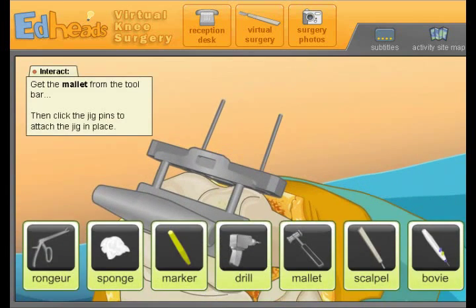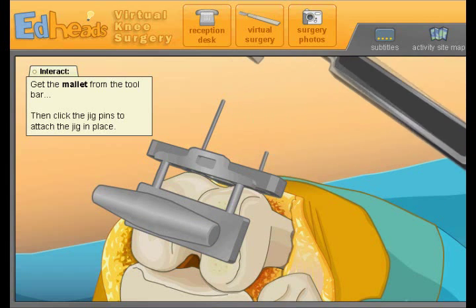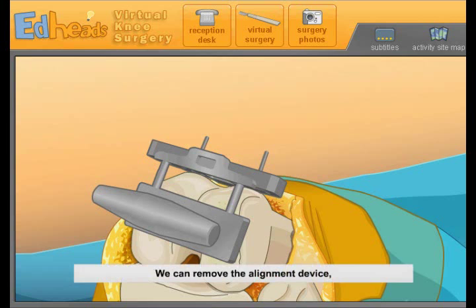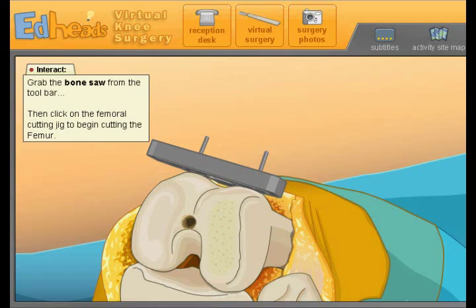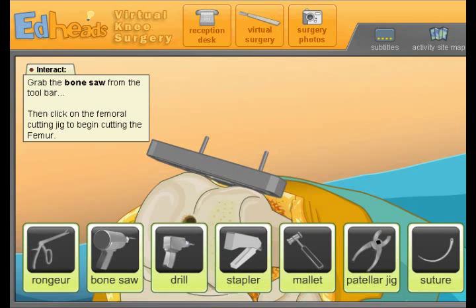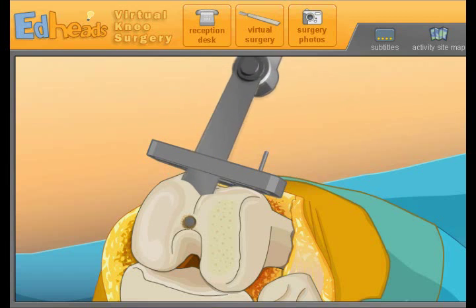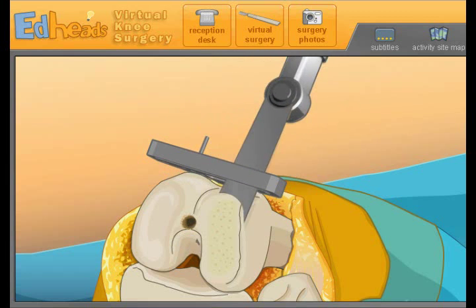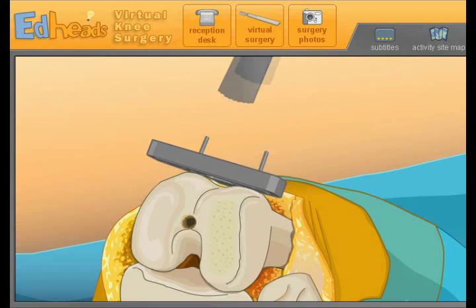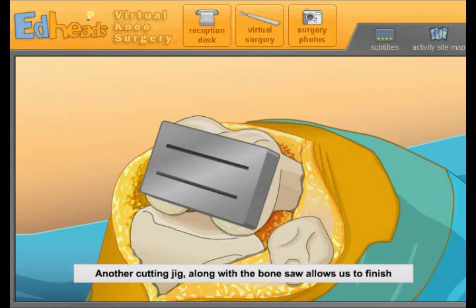The jig is put into position and helps ensure that the cuts made to the bone are exactly what are needed. Now, hammer in the pins to hold the jig — oh no, why do we have a mallet? To keep this thing in place. We can now remove the alignment device; the pins will hold the jig firmly in place. Now for some real bone shaping — use the bone saw to cut the bone so it is prepared for the new femoral component. And now we're going to cut off part of the front of this guy's knee. Another cutting jig, along with the bone saw, allows us to finish shaping the femur.